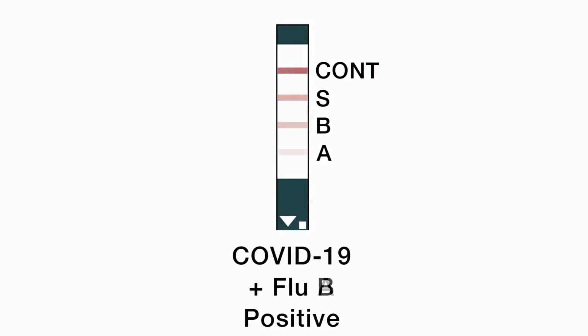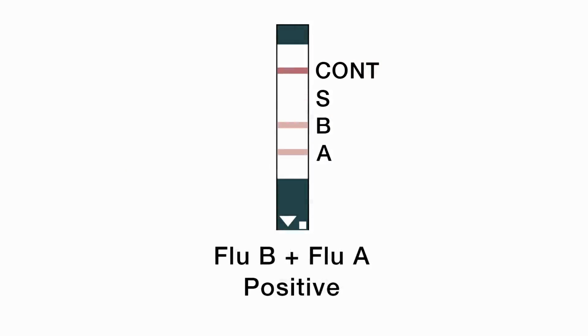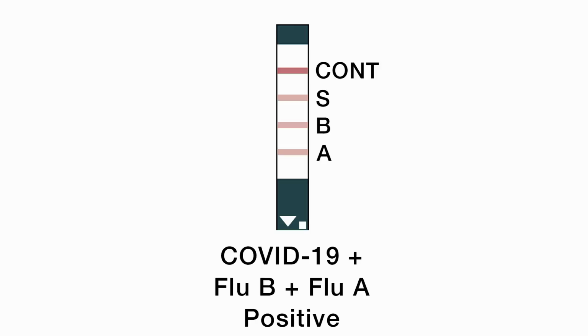Positive test result. If the control line at CONT is visible and any other line or multiple lines on S, B, and/or A appear, the test is positive. Note: any pink or red line, no matter how faint, should be considered an indication of a positive result.